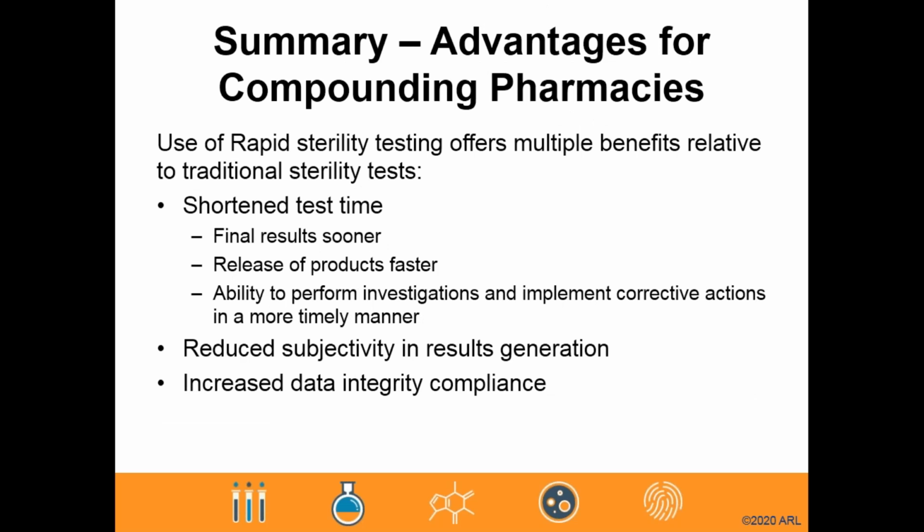Rapid sterility testing offers multiple advantages compared to traditional sterility testing. Most notably is shortened test times. This creates benefits across an entire production schedule, including the release of products faster. With a faster test time comes the ability to perform investigations and implement corrective actions in a more timely manner.